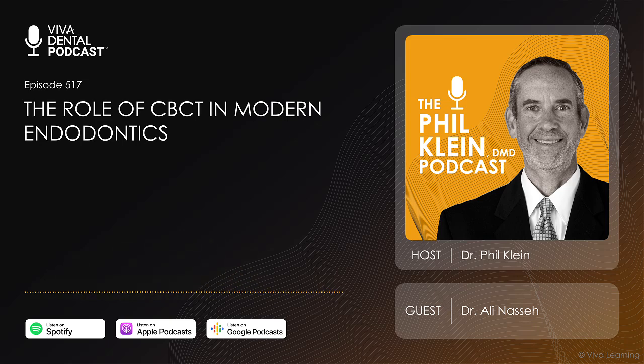So additional information that is provided by the CBCT imaging, which helps build a far more accurate three-dimensional image of the tooth pathology and the anatomy that you're dealing with, will help you decide far better what is the best treatment plan for a given tooth. In a non-surgical case, what are the traps? What are the booby traps in there? Where are the canals coming together? What are the extra canals? Is there a sharp radius of curvature at one area? Those things will help you not only find all the canals, not only get in there and go immediately where you should go, but also know in which areas you should be careful about sharp bends so you're not going to break files.